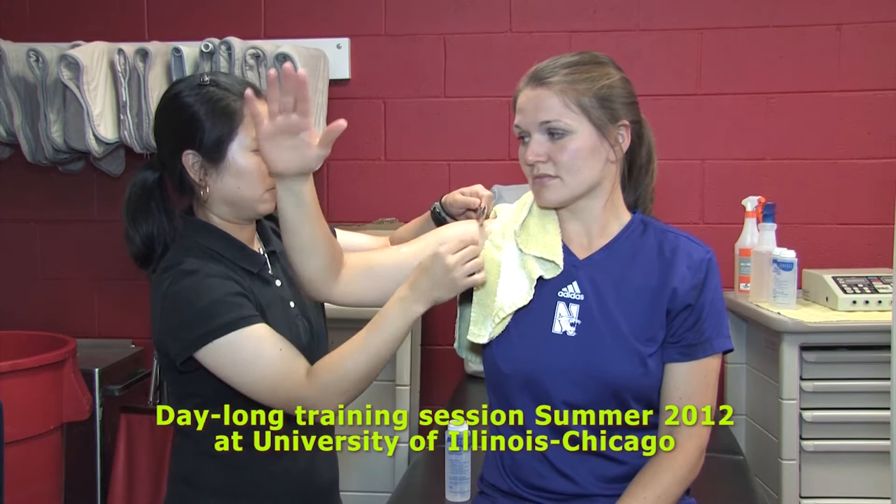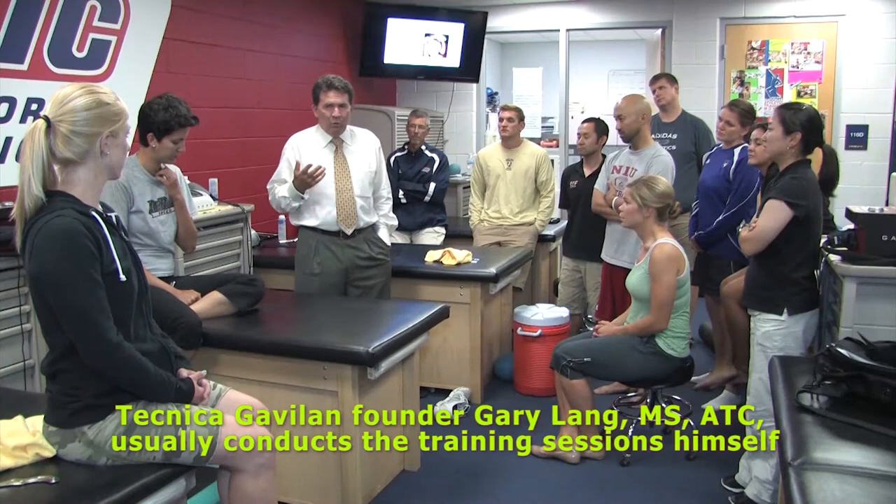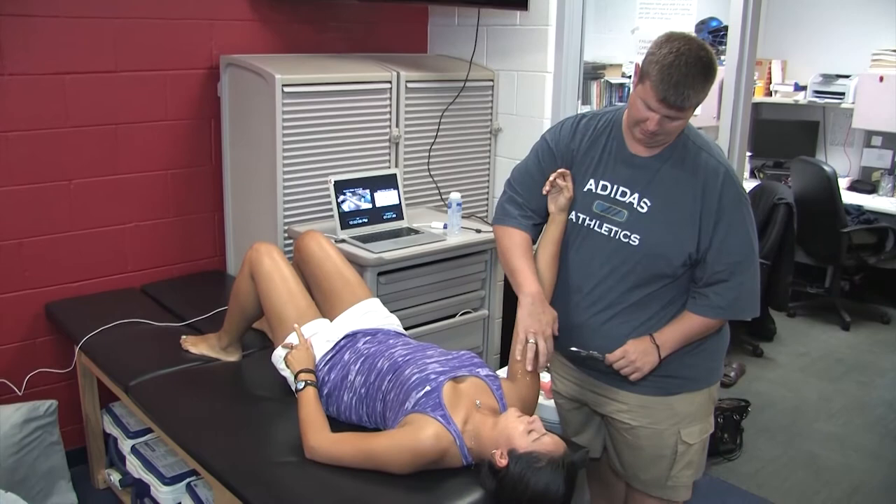She is performing a sweeping technique as Laura's going through external rotation. They're working on the rotator cuff, exposing any sort of adhesions in the fascia. Finding the thing that reproduces the pain, the problem, the injury, and then applying the instrument makes so much difference.